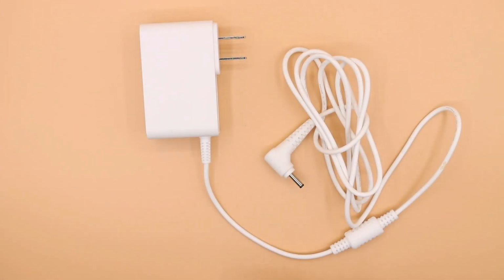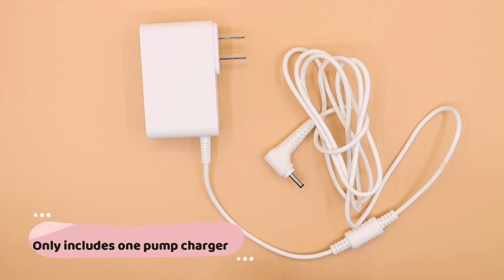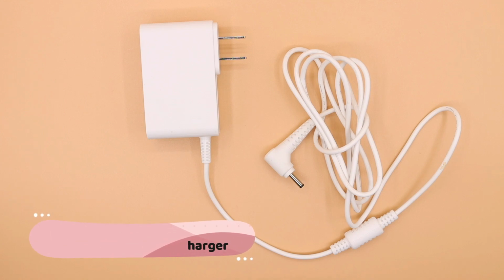The thing I find super annoying is that the pumps do not come with 2 chargers. They only come with 1 charger, and there's 2 pumps, and it takes about 2 hours for the pumps to charge. So that means you have to wait pretty much 4 hours to get to a full battery life. So I ended up having to purchase a separate charger, which I believe was either $25 or $50, which I feel like that's kind of messed up, especially when you're paying $500 for the breast pump. It definitely should include 2 chargers.